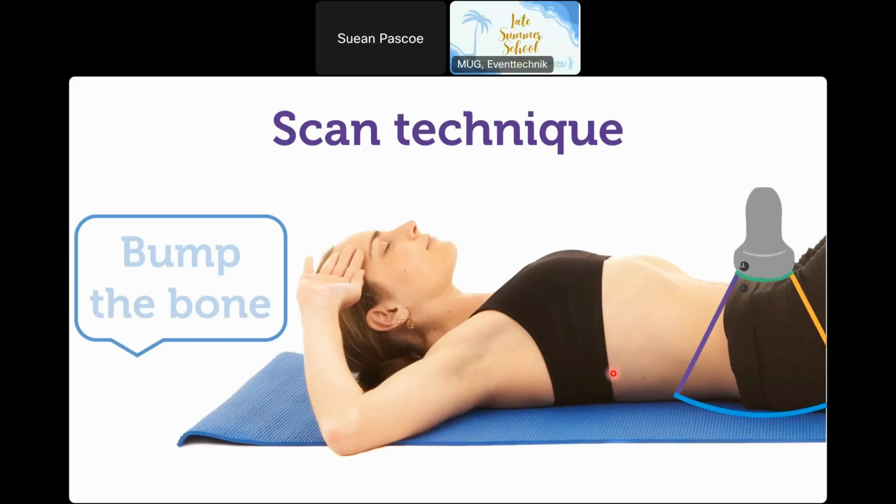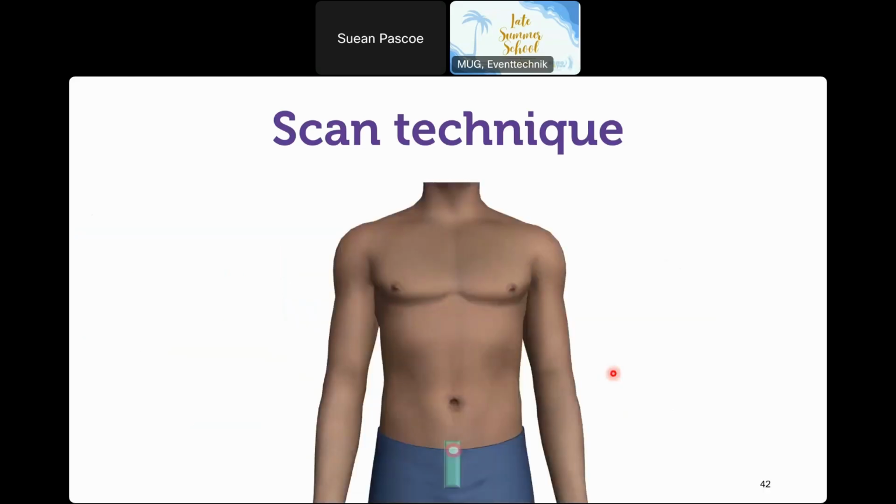Now, it is important that you do use a thorough scan technique, so you are scanning the pelvis, not just the midline. If you happen to have a patient who has endometriosis, the scarring from endometriosis and the endometrial deposits are likely to hang out in the pouch of Douglas as well. And so it can scar it up, and that will mean that you have an unusual sort of pattern for where free fluid would collect.